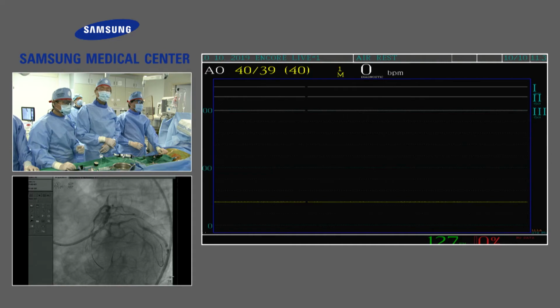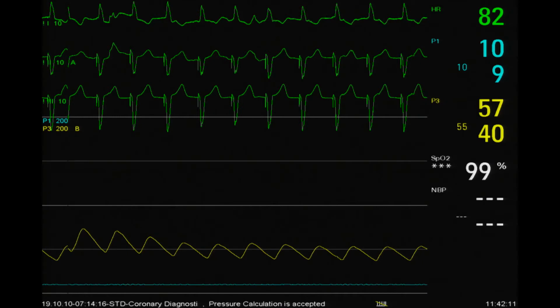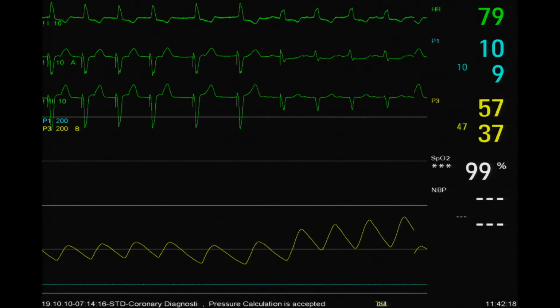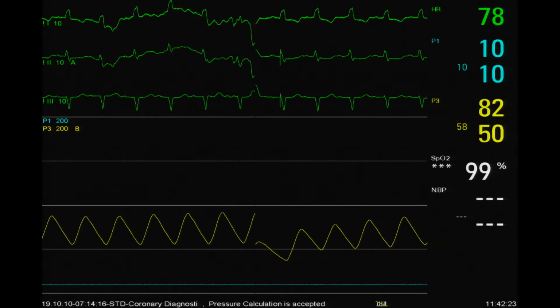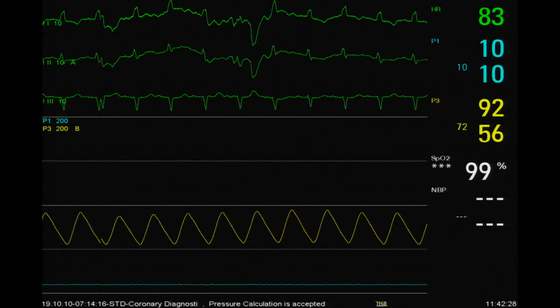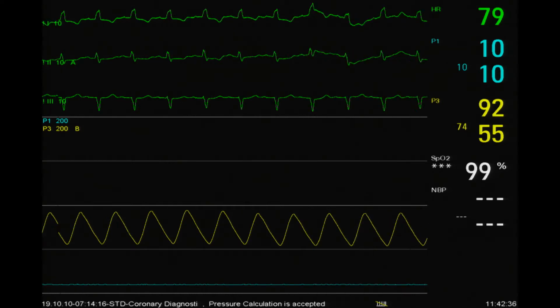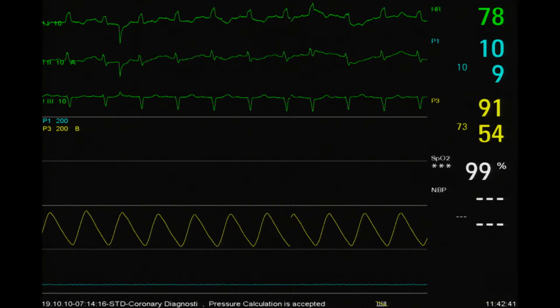We still cannot see the pacing beat. Okay, lower the pacing a bit. Blood pressure is... lower the pacing to 60. Pacing is causing hypotension. I don't know if you remember, but I emphasized in the last session that always after Edwards, you have to be a little bit more patient for the blood pressure to recover. And you see it again and again, and here again. So I just go on.